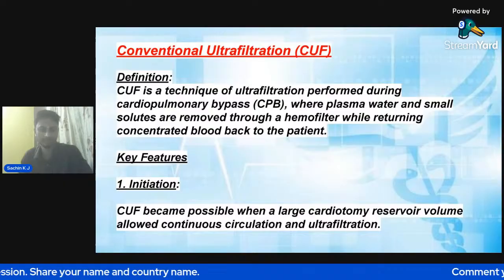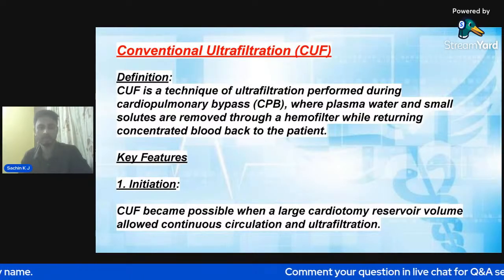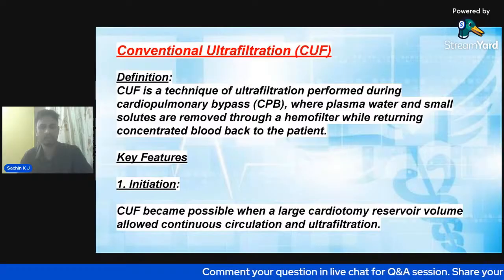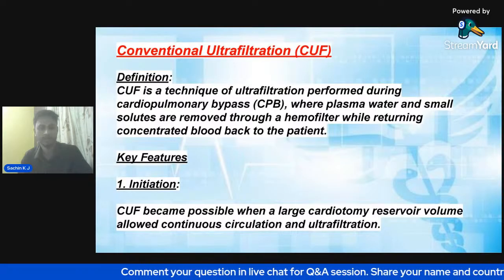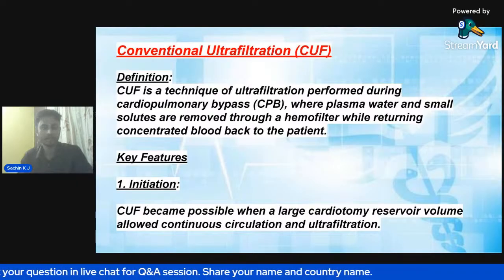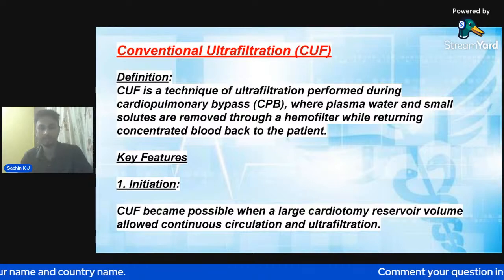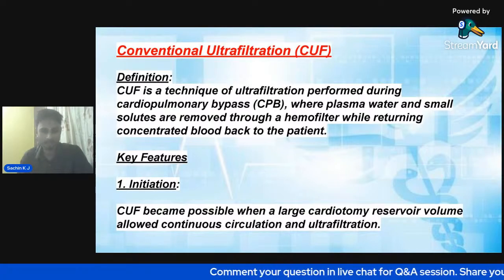Conventional ultrafiltration. CUF is a technique of ultrafiltration performed during cardiopulmonary bypass, where plasma water and small solutes are removed through an ultrafilter while returning concentrated blood back to the patient. Key features. Initiation: CUF became possible when a large cardiotomy reservoir volume allowed continuous circulation and ultrafiltration.